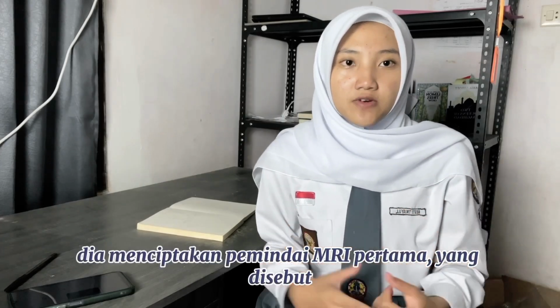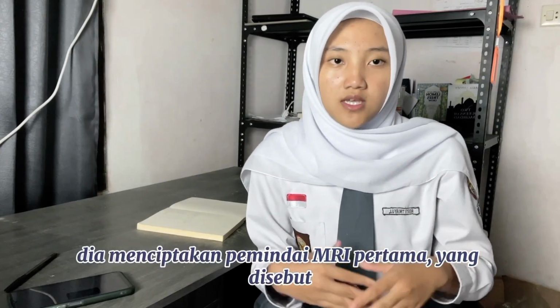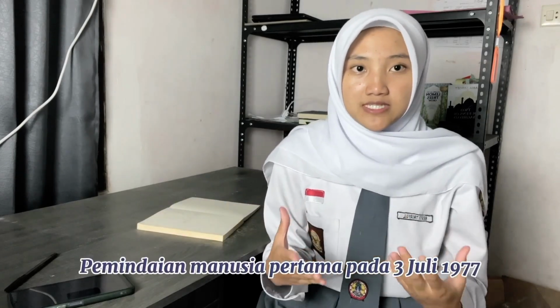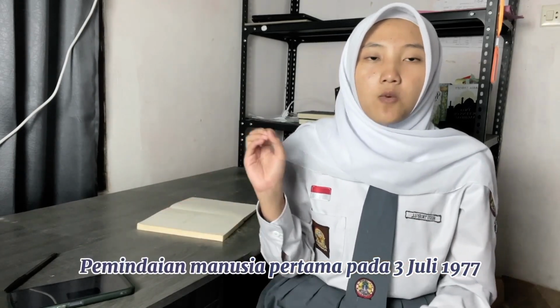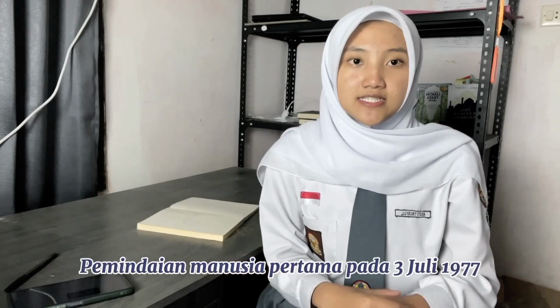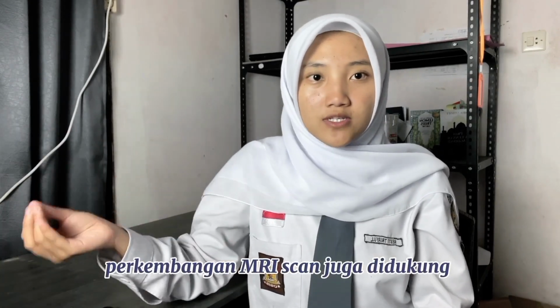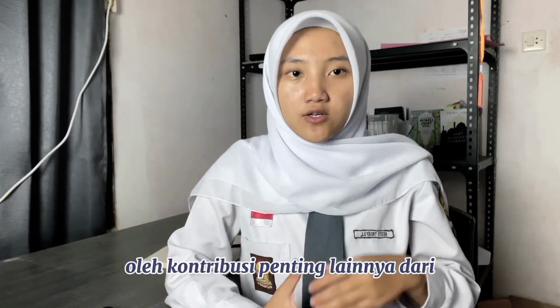He built the first MRI scanner, which he called Indomitable, and performed the first human scan on July 3rd, 1977. But don't forget, in addition to Damadian, the development of the MRI scan was also supported by other crucial contributions by Paul Lauterbur and Peter Mansfield.